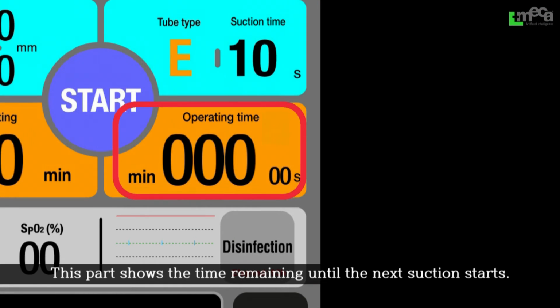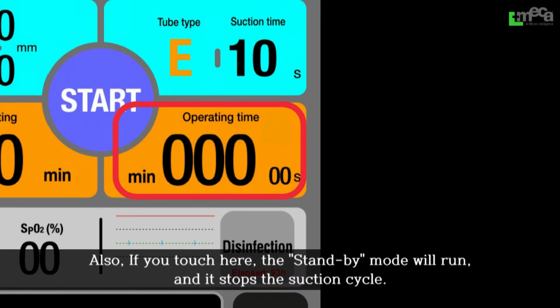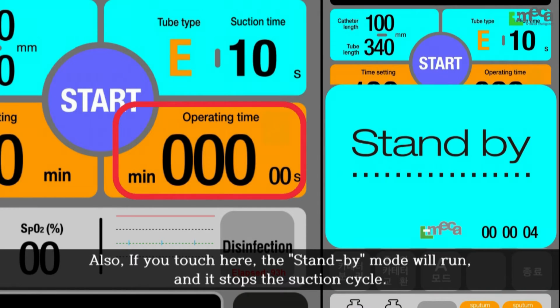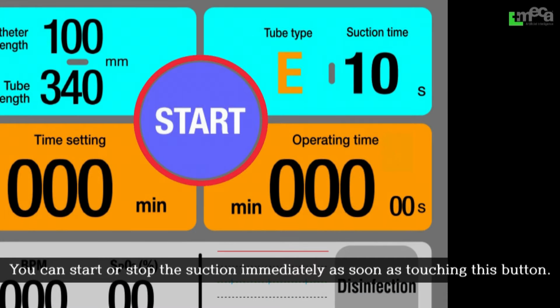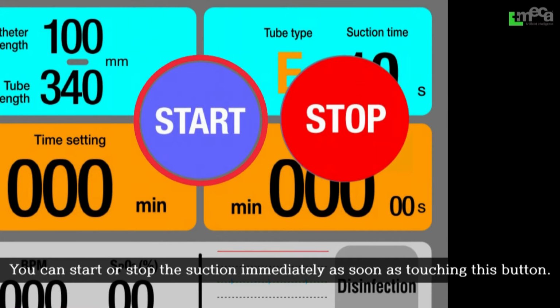This part shows the time remaining until the next suction starts. Also, if you touch here, the standby mode will run, and it stops the suction cycle. You can start or stop the suction immediately as soon as touching this button.